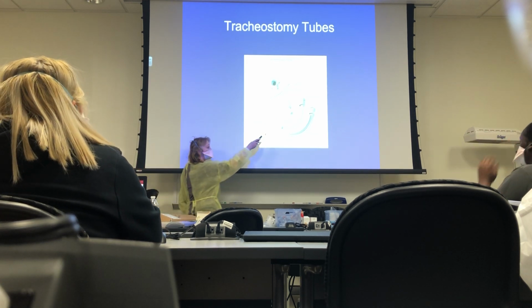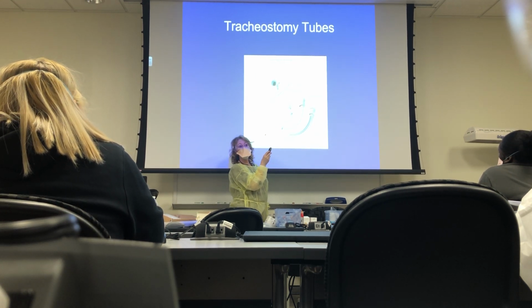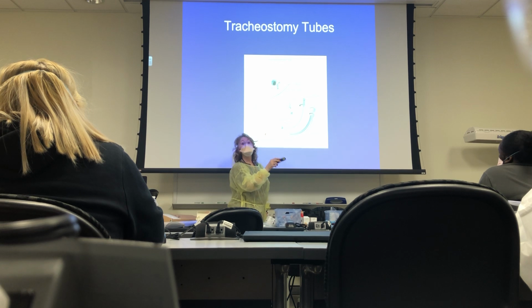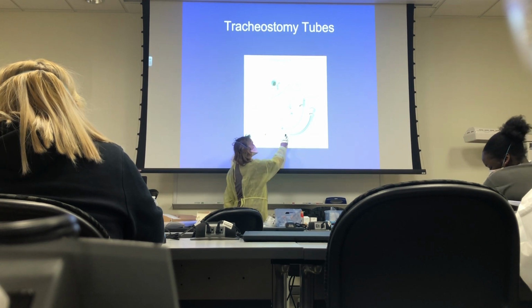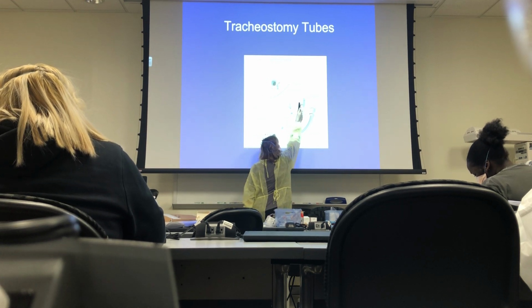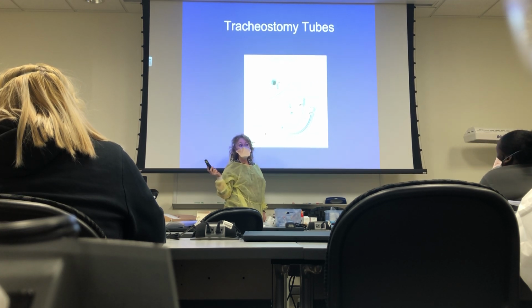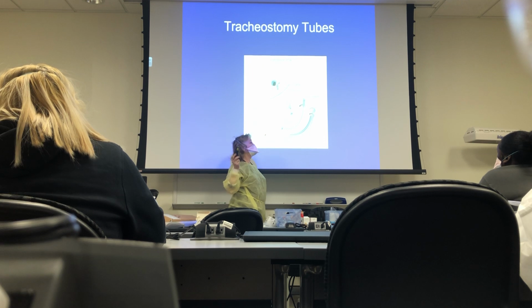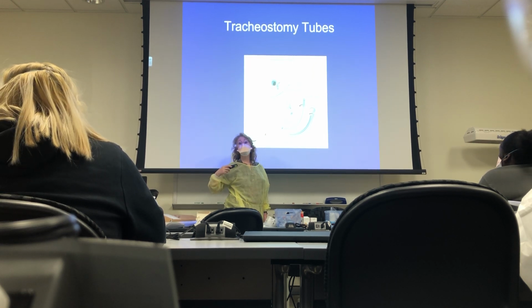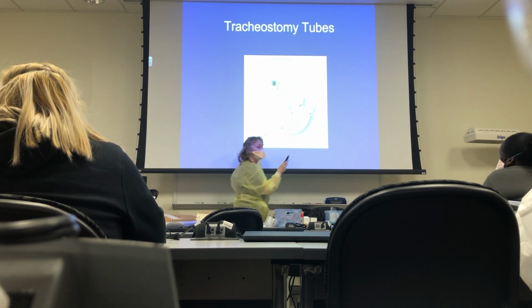Rounded tip on the obturator, what's that for, guys? When do we use the obturators? On insertion, to prevent mucosal trauma. Okay, you've got a 15 millimeter adapter, what connects to that? Will ventilators connect to it? Will bags connect to it? Will a T-piece connect to it, to set up an aerosol T-piece? You have the standard adapter, okay? You have the outer cannula, the inner cannula.